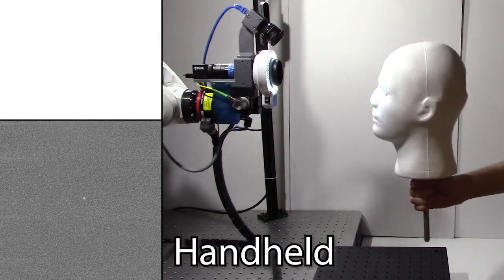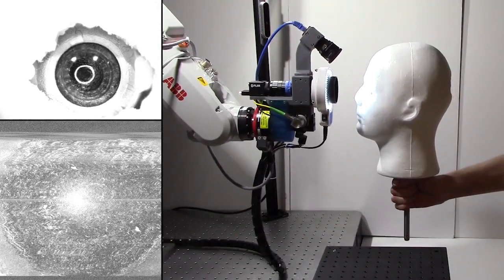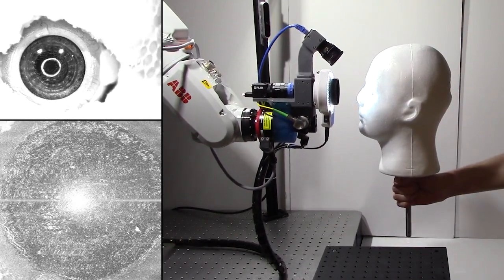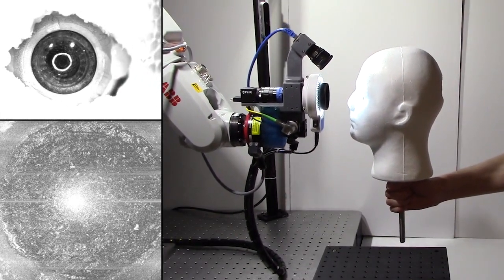Finally, we show alignment with eyes undergoing physiologic motion. Despite tremor and small-scale drift, the scanner is able to obtain largely stabilized OCT volumes of the eye.